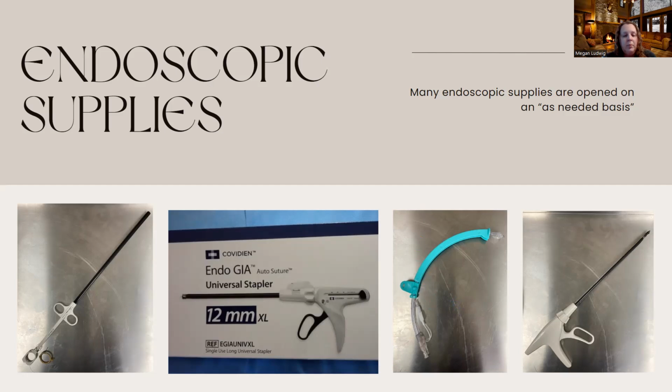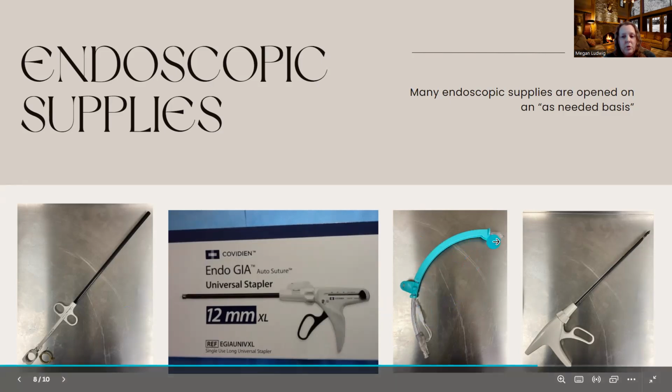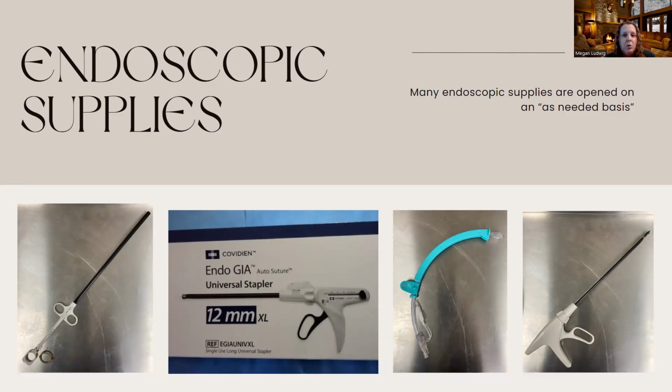Let's say we're looking at the tubes and ovaries through the scope in the abdomen, but maybe we need to see behind the uterus. So what we can do is put this in through the cervix and into the uterus, and then someone can manipulate, we call it manipulating the uterus. So if you push down while this is in place inside the uterus, it's going to elevate the uterus if you're looking at it inside the belly.